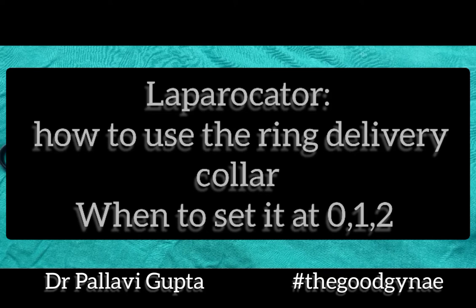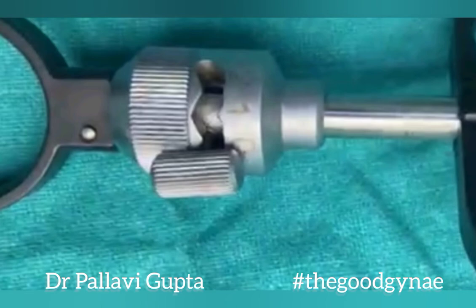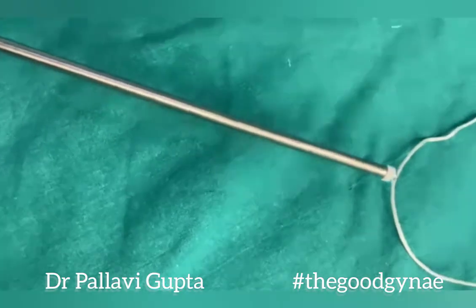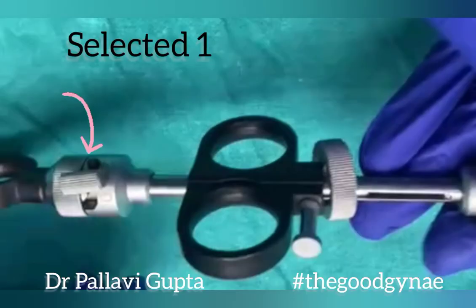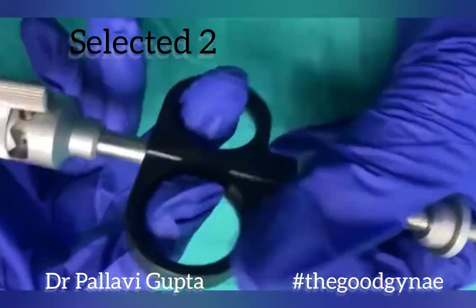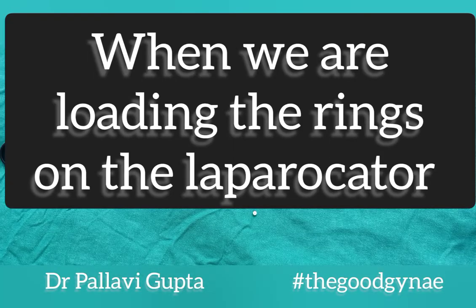Today we are going to learn how the ring delivery collar of a laprocator works — when to select 0, 1, and 2, whether one ring or both rings are loaded, and what happens when we select the wrong number. At the distal end of the laprocator, there is a sheath within a sheath. At the distal half centimeter, the inner sheath is where the rings are loaded. The inner sheath goes in partially when number 1 is selected, and completely when number 2 is selected at the ring delivery collar.